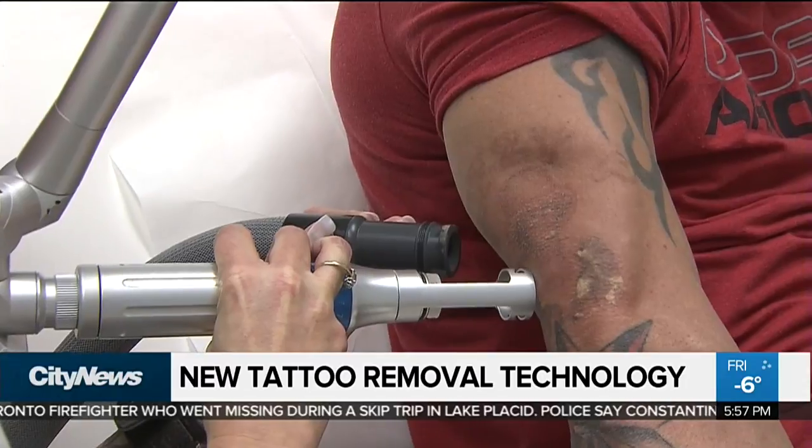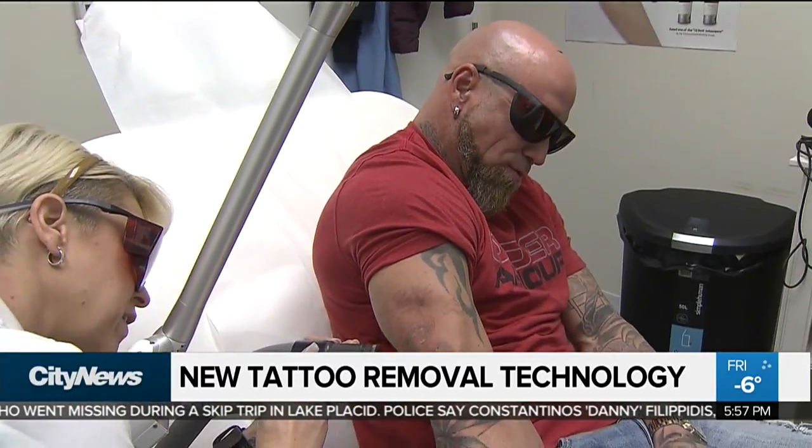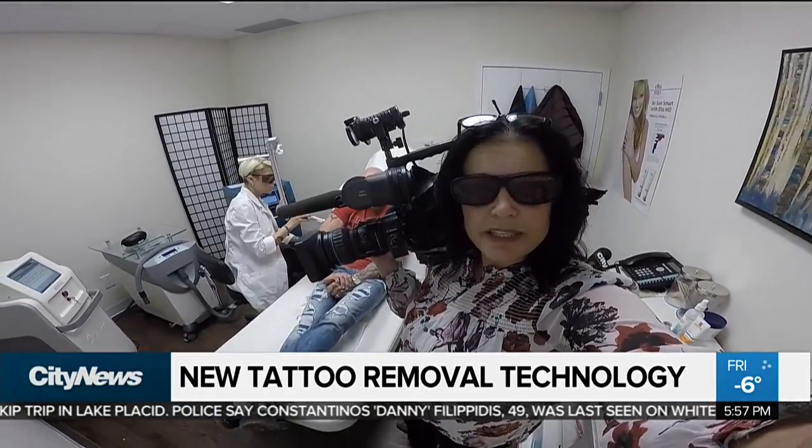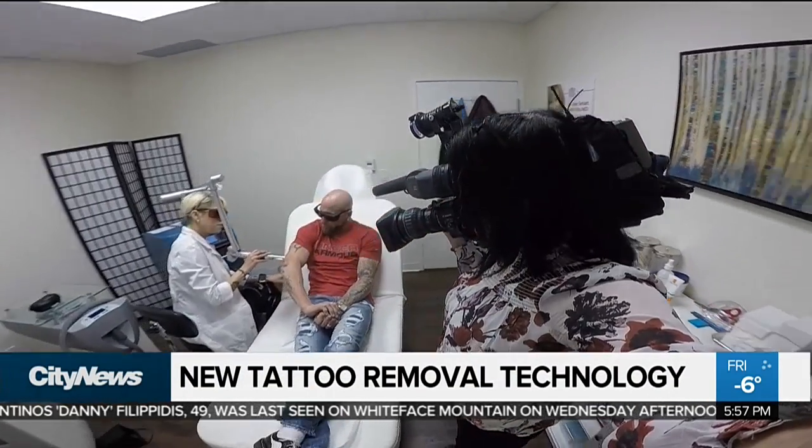But with this machine you can actually reduce the number of times you have to suffer through that pain. Clients can actually reduce their treatments from the traditional 10 to 20 sessions right down to about 6 to 8 on average.